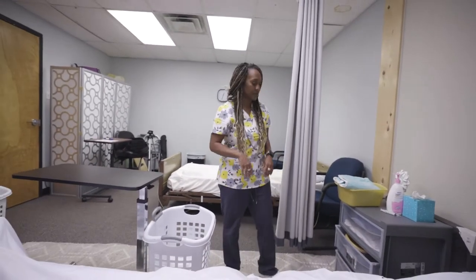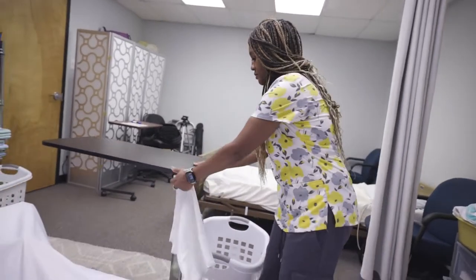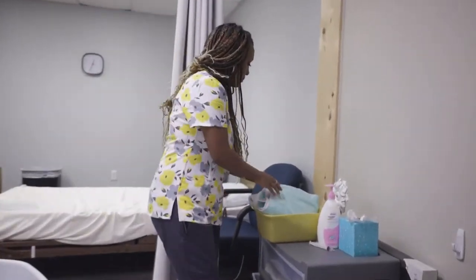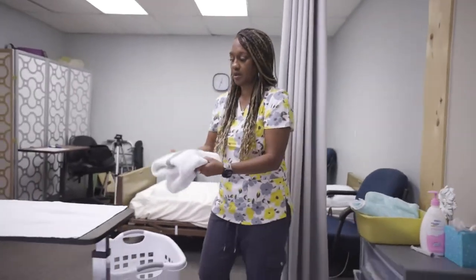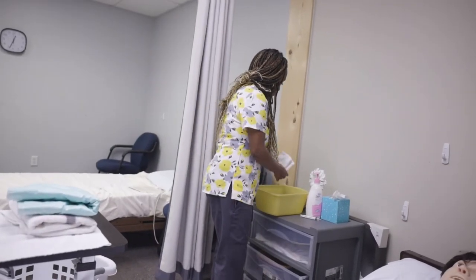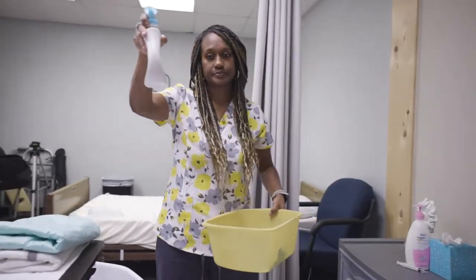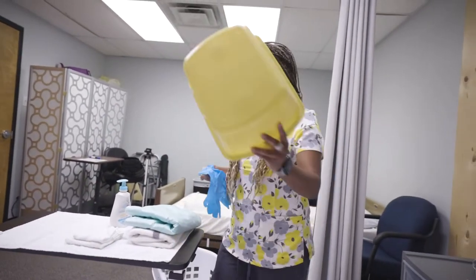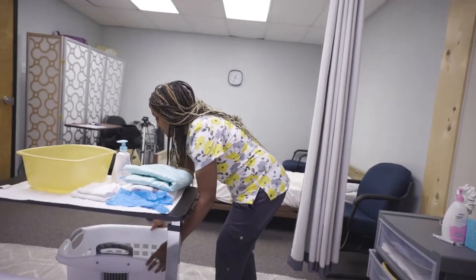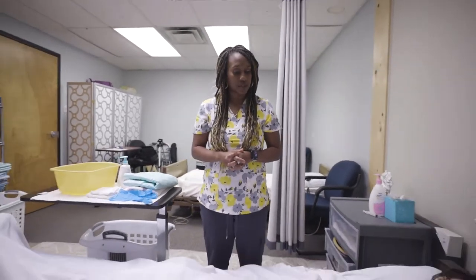Let's walk through the supplies we need. First I have a barrier — I'll put this on my table. Next I have a dry towel and a barrier towel, and then I have my pad. I have two towels: one wash and one rinse, soap, a pair of gloves, and a basin. I put my dirty clothes hamper right next to me and my trash is right there — you always want to make sure you have those items next to you.